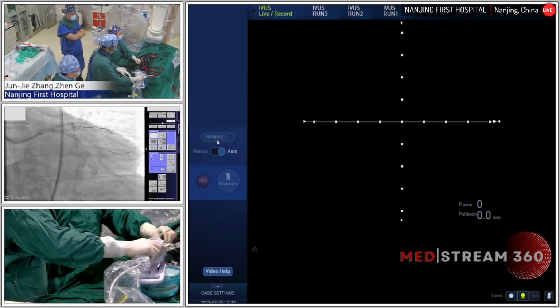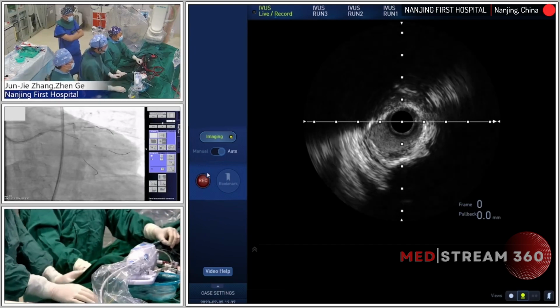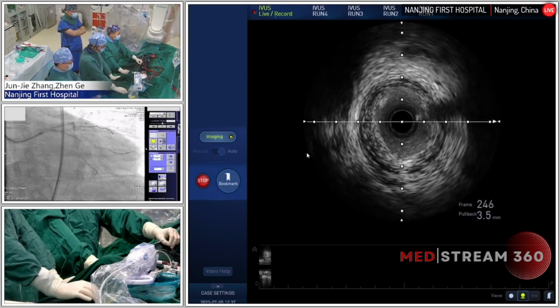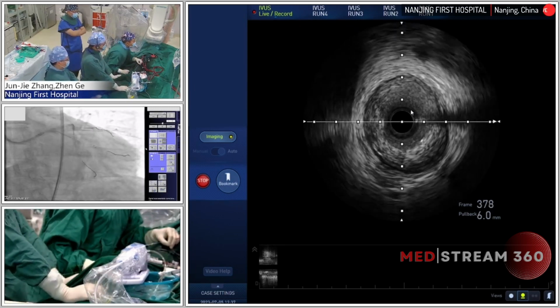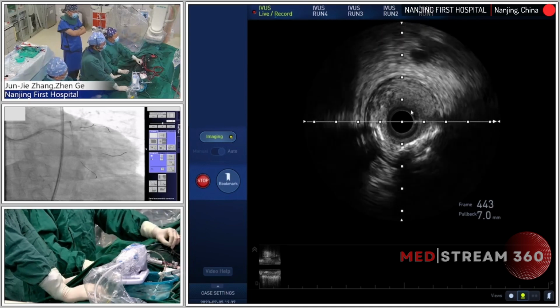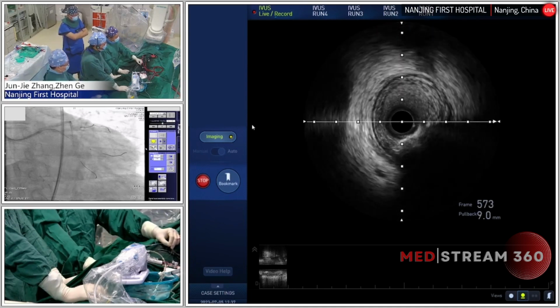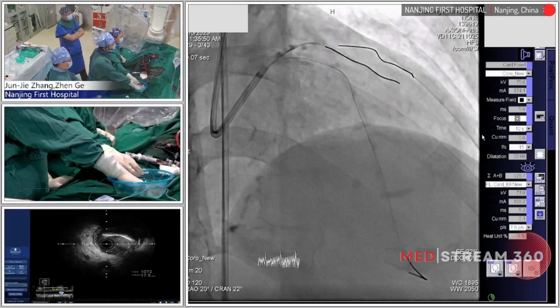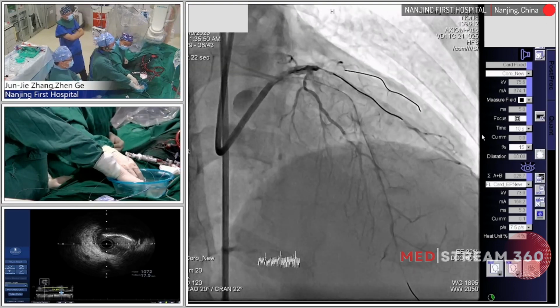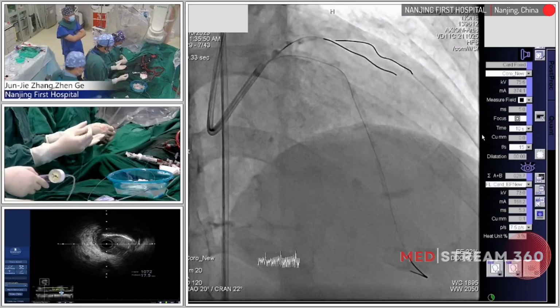Okay. So this is after 2.5 NC balloon predilation. And here I will pull back. The vessel diameter is about 3.5. And at this point, the plaque burden is not more than 50. Good. Yeah, maybe here is a landing zone if we use a DK crush for circumflex. So first stent, I want to use the 2.5. Is that okay? Yeah. 2.5 by 18 stent.